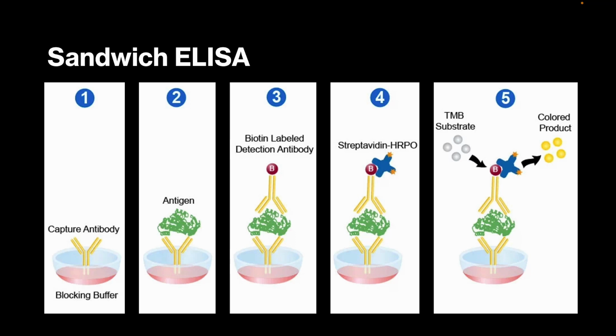So I think it's clear how different types of ELISAs work, and the most common is sandwich ELISA, which is used in different research labs as well. It is the most common technique used worldwide.